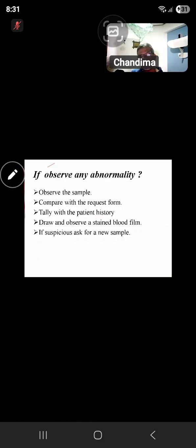These fungi contaminated the blood and were counted as white cells, giving an erroneous white cell count. Those fungal cells were counted as lymphocytes. That's why the patient had a higher number of WBC and lymphocytes. So by looking at a blood film in an abnormal situation, we can correct most of the errors that occur in a full blood count.